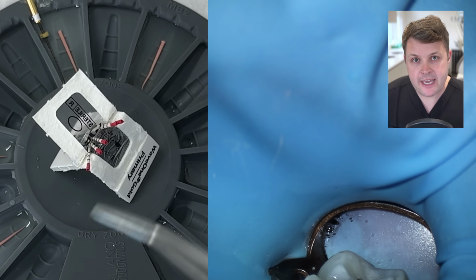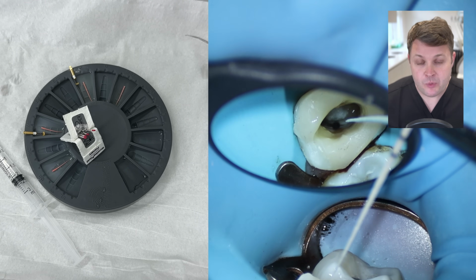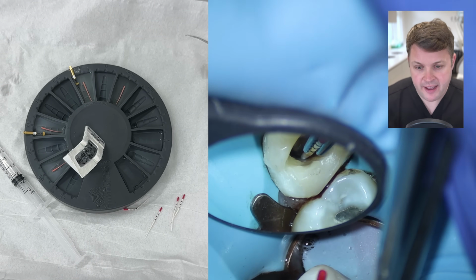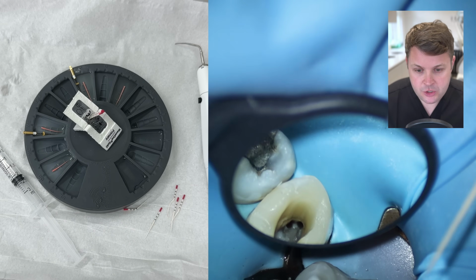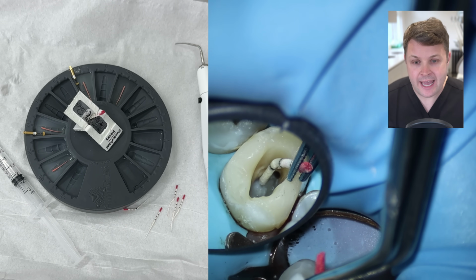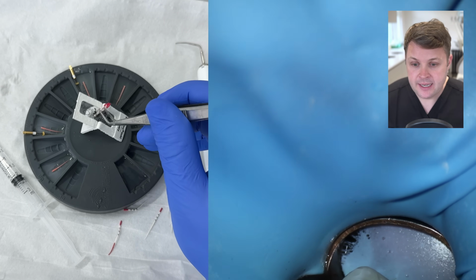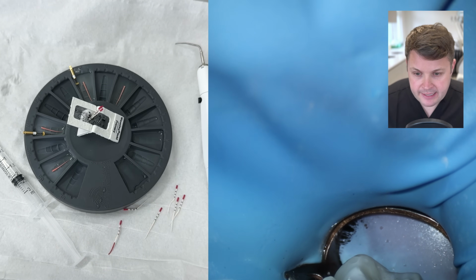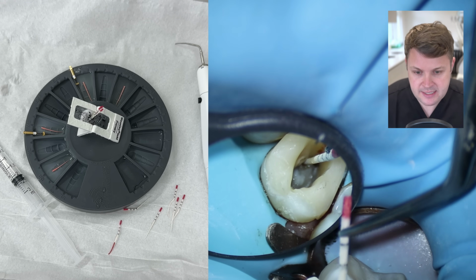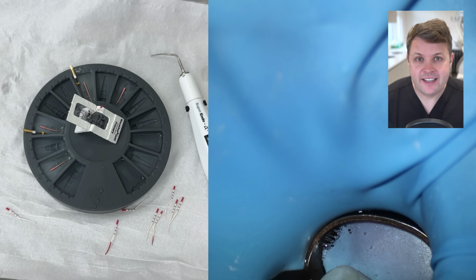Once we finish the irrigation protocol, we're ready to dry the canals with our paper points. With hindsight, I made a slight mistake here, because I'm not really taking note of how far I'm pushing these paper cones down. So obviously we dry some of the canals, and when I place a paper cone into the MB, I feel like I'm pushing it too far, and it's gone through the apex, and I've caused a little bit of bleeding here. And then of course I place a paper cone in the MB to see if I can stop this bleeding, and also the MB2.